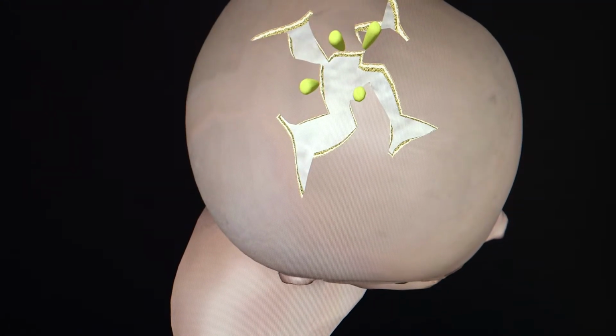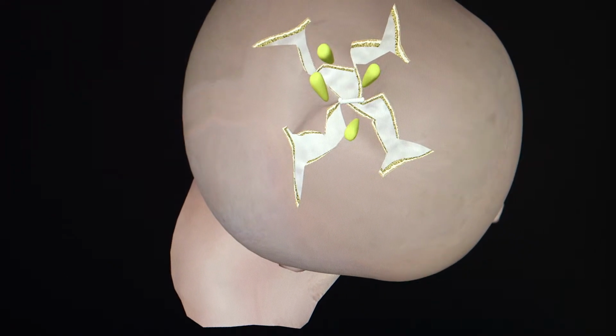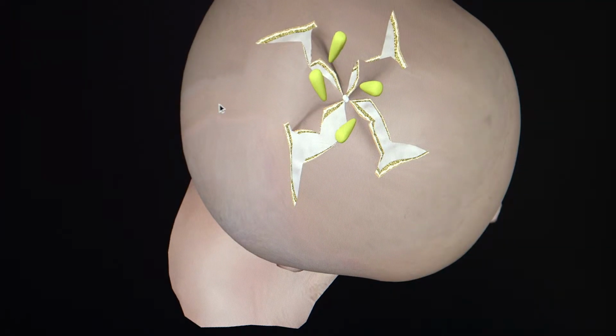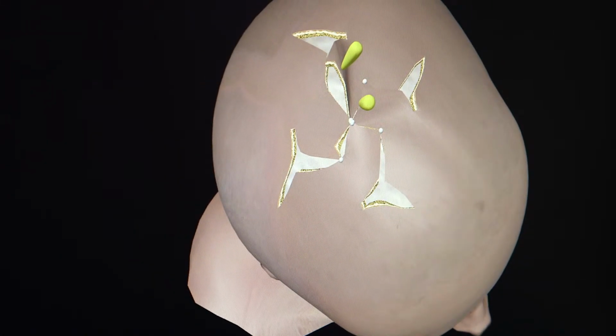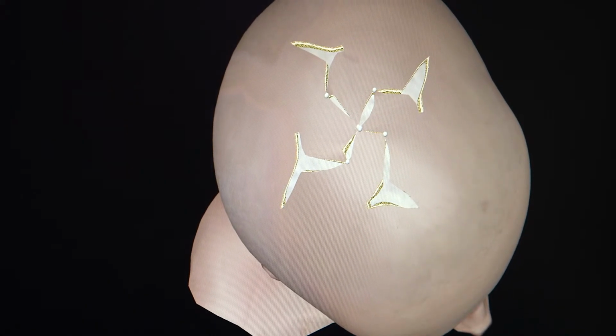So fortunately, this is not the only activity that tries to place computer-aided simulation in the service of medical training. However, I would say that the unique perspective of this particular work is that it does not focus on the tactile aspects of what it feels for a surgeon to cut skin. I would consider that as a complement to our own activity, but the specific nature of our work has to do with the fact that we're concentrating on generating three-dimensional shape by using cutting and suturing as the building blocks, and also using the simulation of real tissue mechanics in order to aid the user of the system.